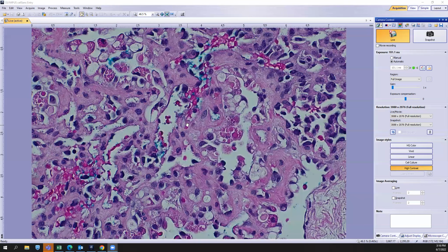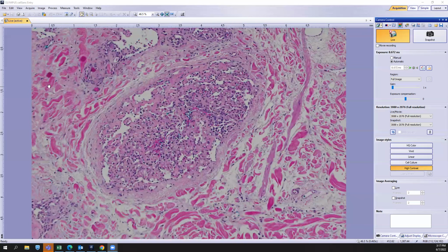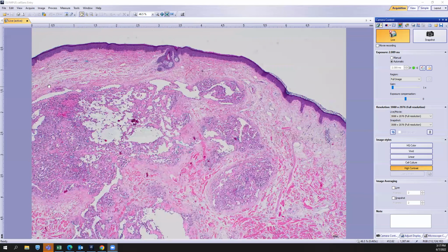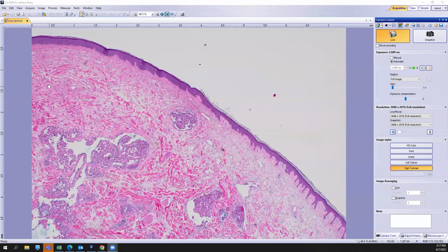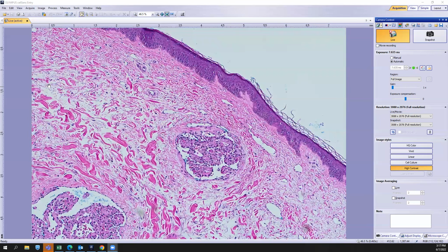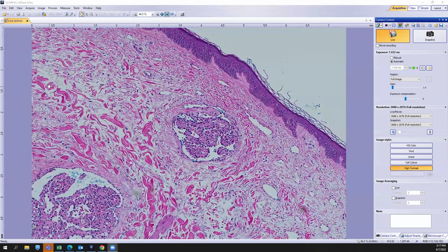And there's been some studies to kind of figure out what this is. It may be some type of basement membrane component here. You can see them nicely here. So overall, putting these features together with the relatively well circumscribed nature, it doesn't look like a malignant vascular neoplasm, with some areas that look like they're forming renal glomeruli. So you could definitely think about a glomeruloid hemangioma here.